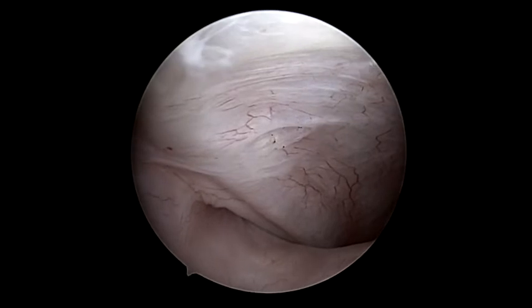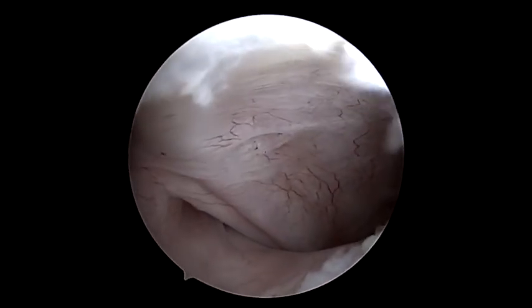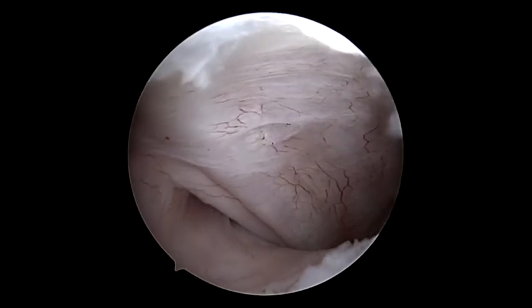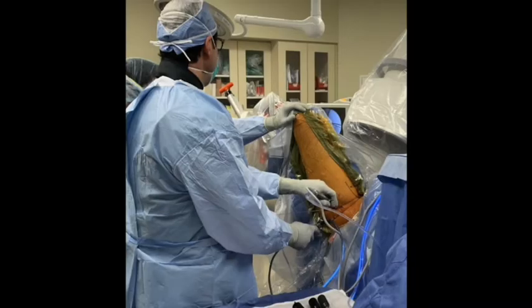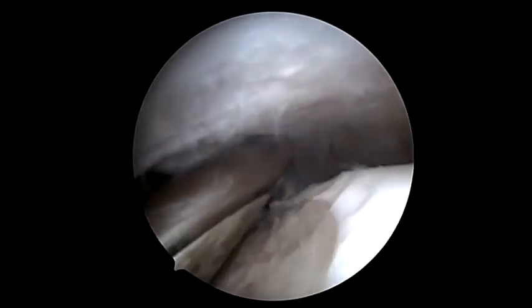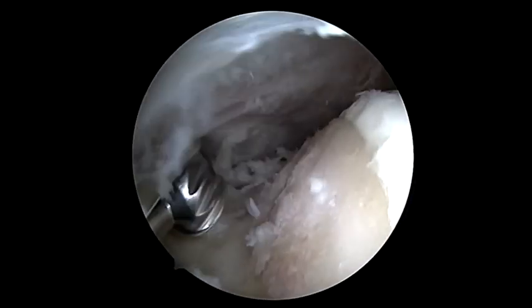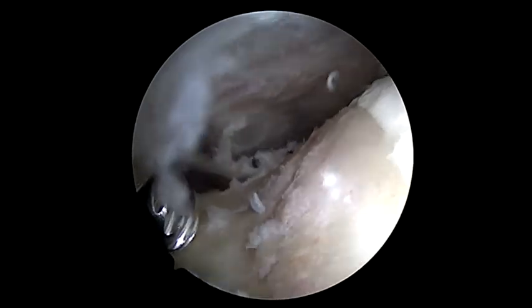As shown in the zona orbicularis, the capsular vessels can be seen in this region. Great care is taken to avoid iatrogenic injury to this area. Again, with the hip flexed and externally rotated, the arthroscopic visualization can be seen with the burr mobilized in the inferior medial direction, addressing this portion of the cam lesion to provide decompression.